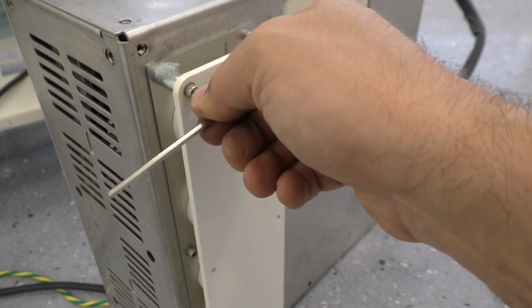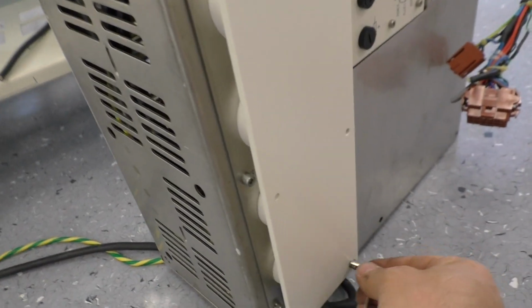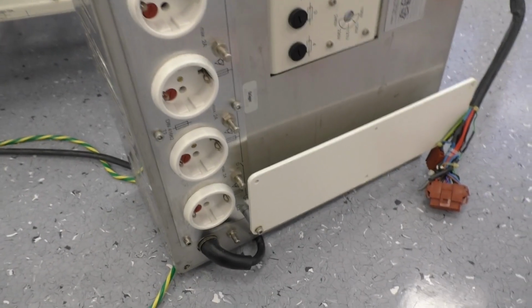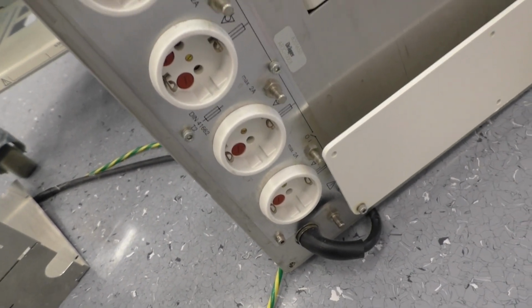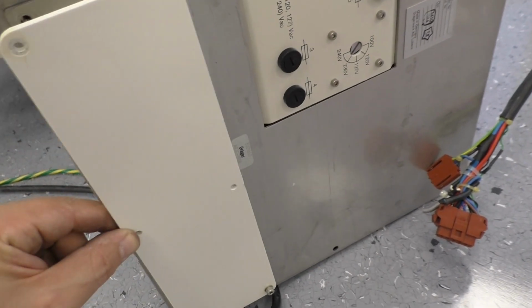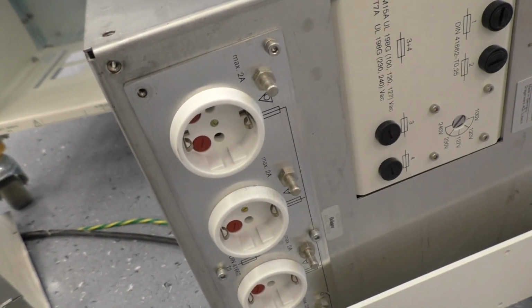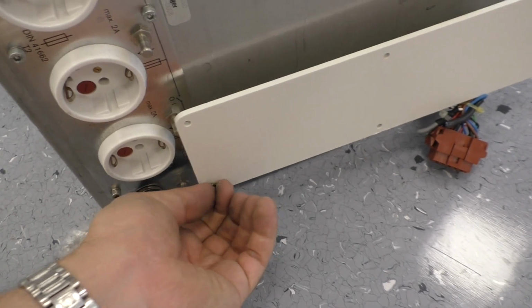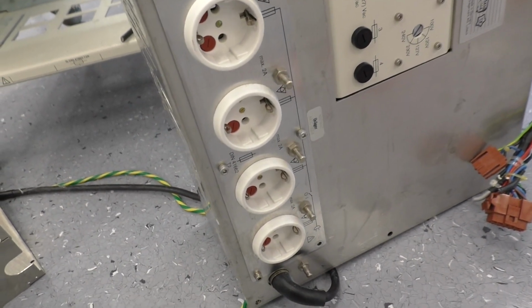Let's see how it looks without it. The reason why it is covered is that there are so-called Schuko plugs, which are used in Germany and Eastern Europe and some other parts of Europe, but they are not used in Switzerland. So they simply covered that because they didn't want someone to use it here. For example, in Germany, I'm pretty sure this cover is not in place and they can use the insulation transformer, the big blue one, to power external devices.